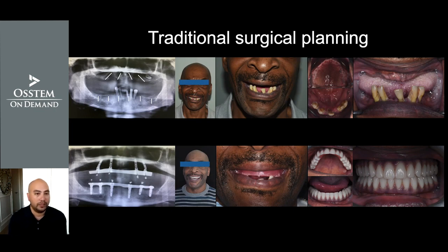Traditionally, we used to plan the case on a panoramic X-ray, like in this case, you can see in the white lines. And then we take intraoral pictures with occlusion and front views. And then you can see the case completed with the implants positioned where we initially planned, and with the delivery of a final hybrid prosthesis restoration with composite denture teeth and a titanium bar.